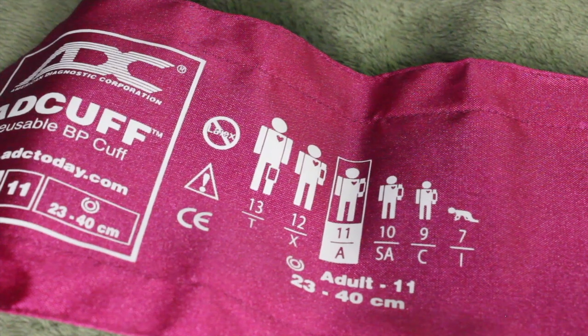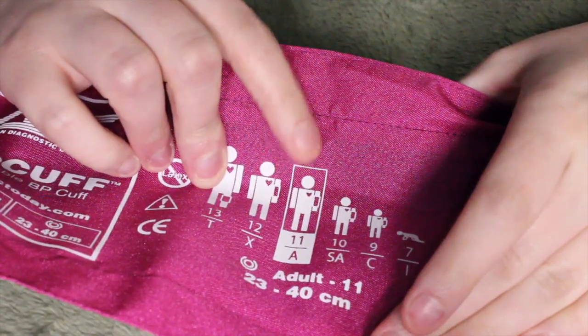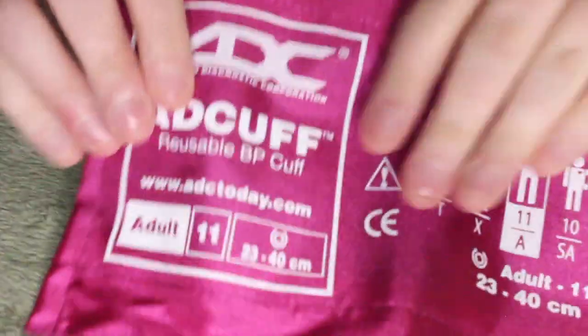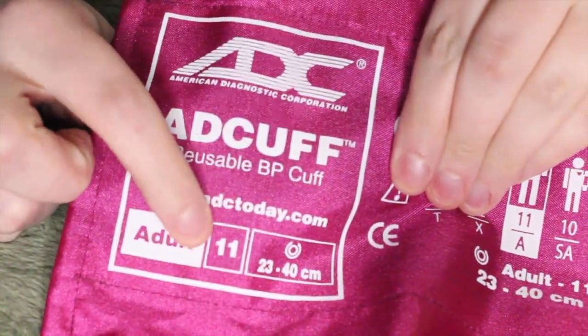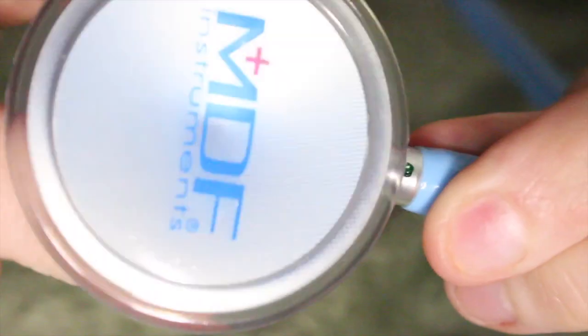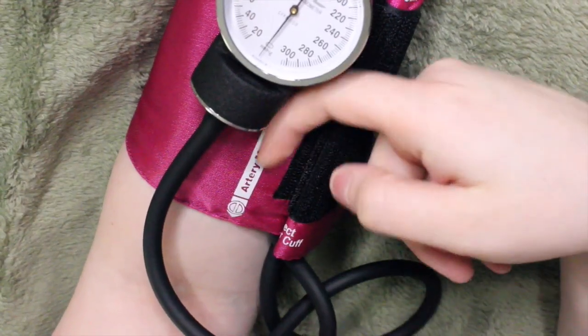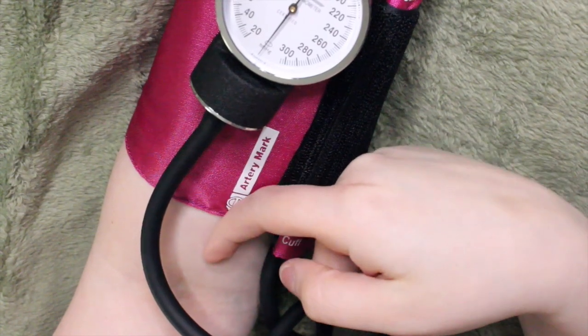To take the actual blood pressure you will need to determine what size cuff you need. The standard size is a size 11, which is used for most adults; however, if the patient is overweight you may have to go up to a size 12. Begin placing the cuff on the patient's arm — you do not want it too tight, but also not so loose that it falls down. If you have a dual-head stethoscope, gently tap on the bell to ensure it is on the right side, and always make sure the artery arrow is pointing downwards.